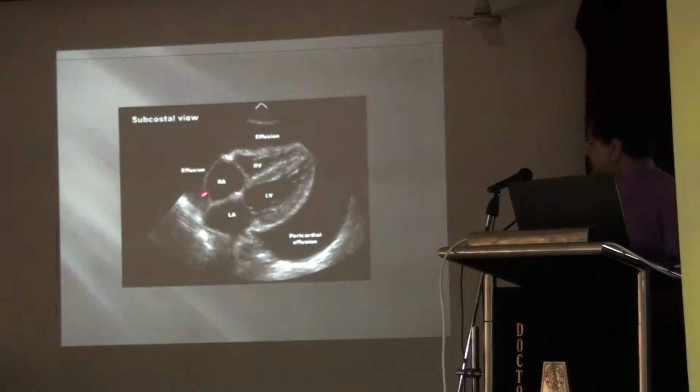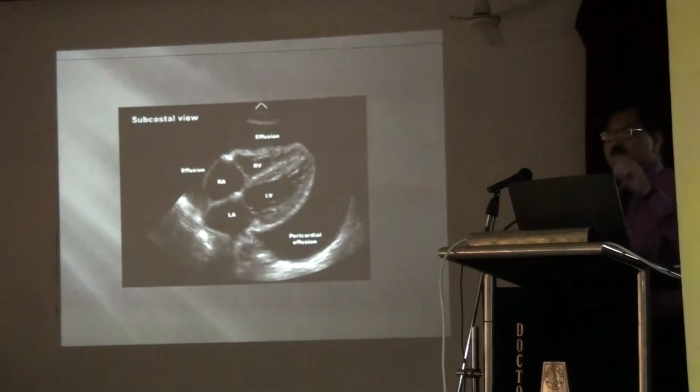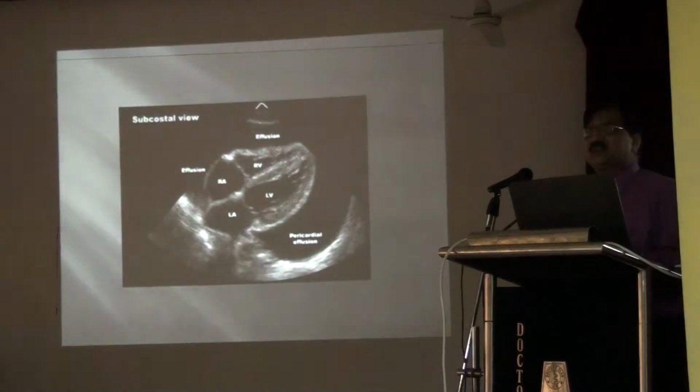For that lady we will do pericardiocentesis. Pericardial effusion is a very important finding. We can see it in 10 seconds hardly. This is the heart. The heart moves inside, just like in water, and the heart will float. The most dangerous sign for this is known as the big swing.